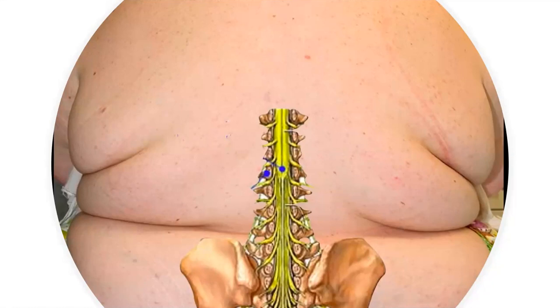What can be even more dangerous and scary is that what you may palpate to be the iliac crest might actually not be the iliac crest. It might just be a fat fold. And where you think you are at L4, L5, you might actually be in between L1, L2. So extreme caution does need to be applied in these patients.